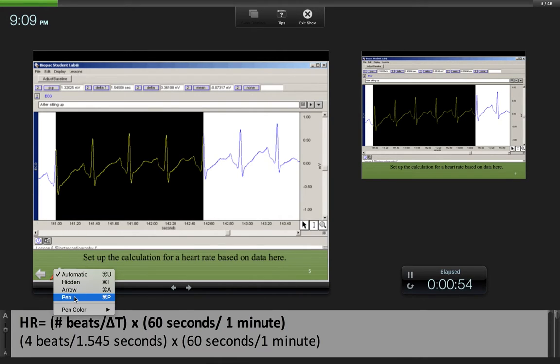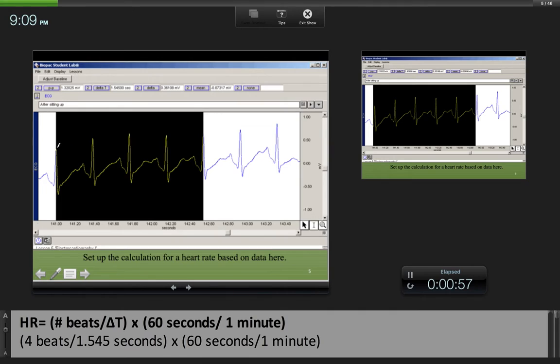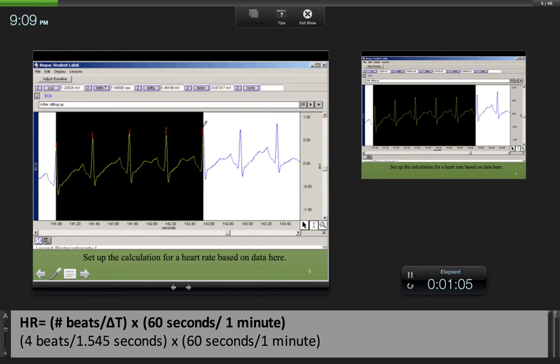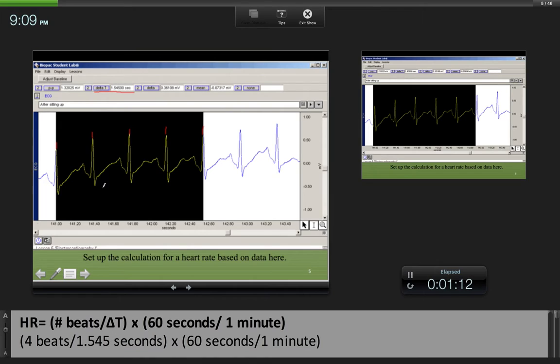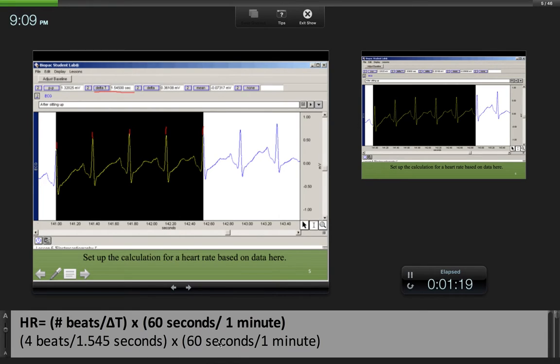We need to know the number of beats. We're going to go from a QRS peak to a QRS peak. That is one, two, three, four - we have four beats. And then delta T gives us the change in time that it took for those four beats to occur. We're going to set that up and then multiply that value by 60 seconds over one minute, and that'll leave us with our heart rate in beats per minute.